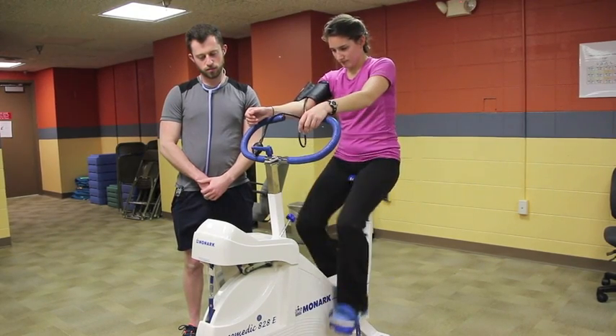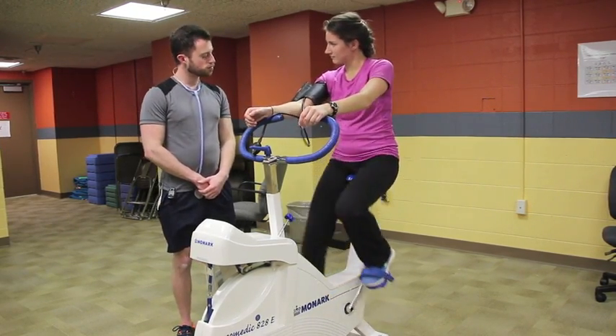Monitor the client for signs and symptoms at all times and watch for test termination criteria.